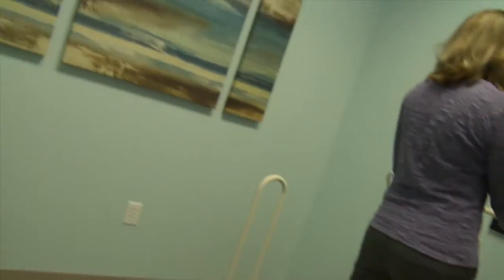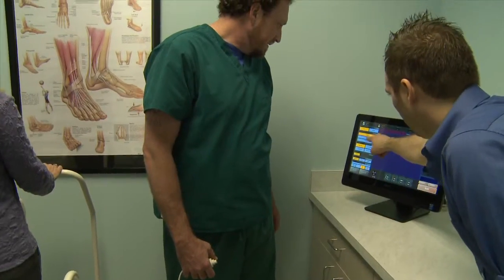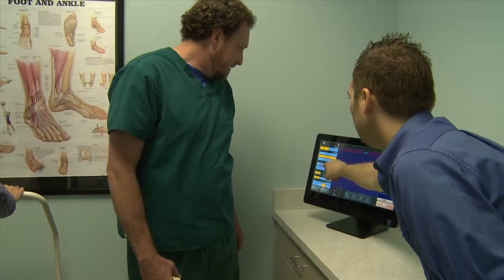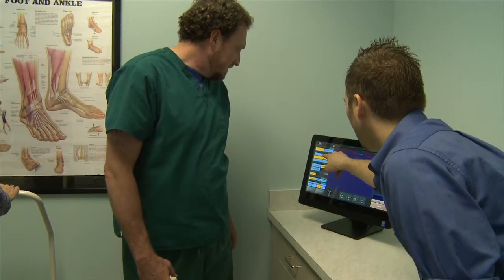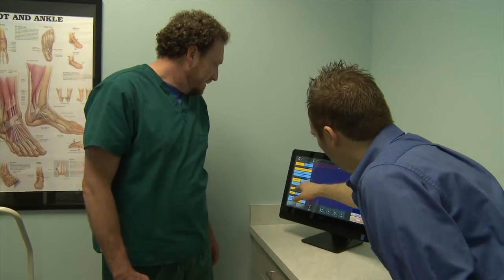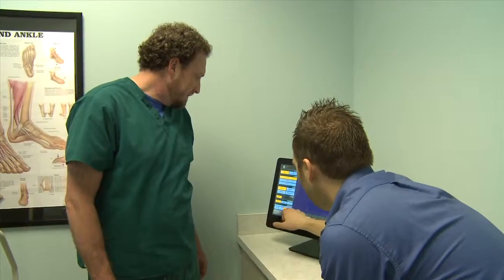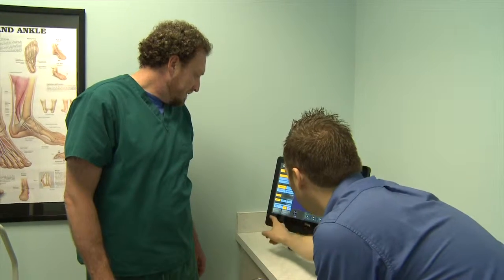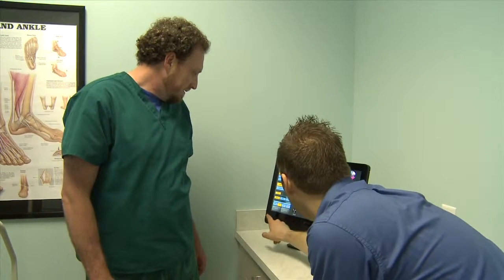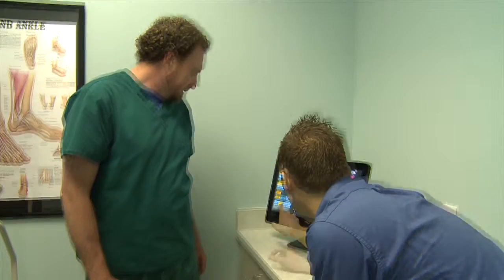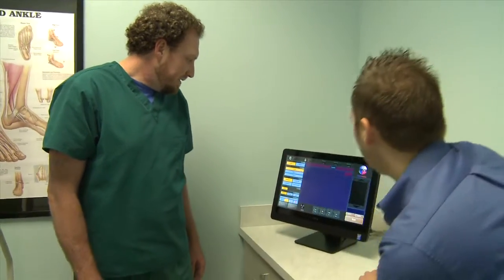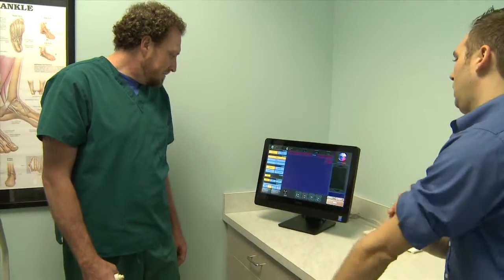At the top you select left or right foot, and you have categories — so if you're doing an ankle, you'd change the view there. Those are the foot views, and we're currently on an AP. You can also adjust for patient size — if they're a bit smaller, bring that down and it'll adjust the technique accordingly.